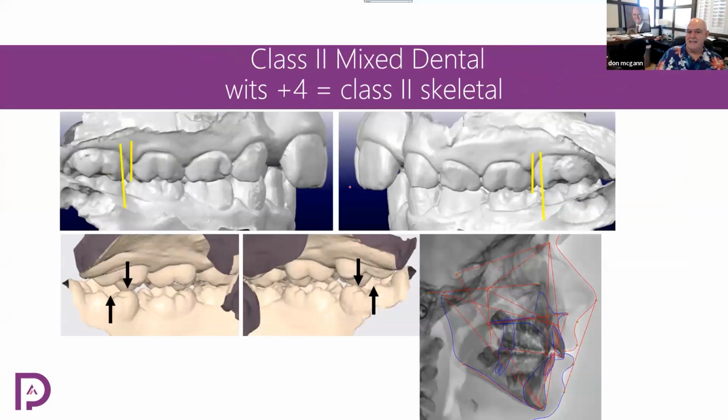So, in this set of cases, you can see I have a class 2 looking primary molar. You're welcome to apply the vertical lines there. Whoops. Sorry, I didn't do it right. Oh my gosh. Okay. You see how confusing it can be? Don't do this. Okay, so this is class 2, but you can do the same thing at the molar. So you're going to be placing this line and this line. And then it's going to calculate how much class 2 you have automatically once you place the line. You can do it anywhere up and down the arch here, okay?